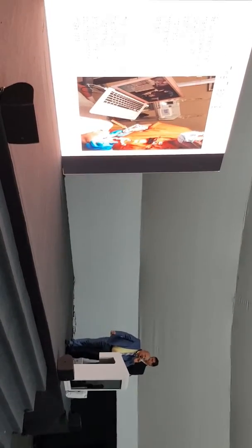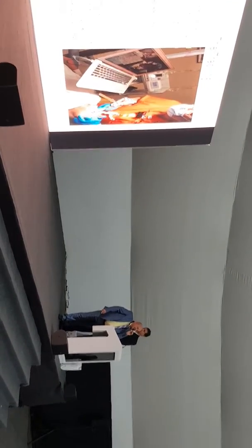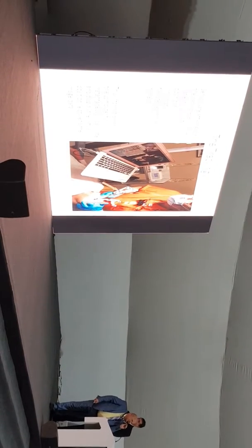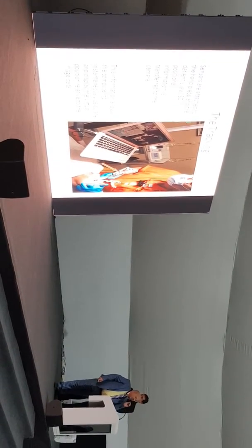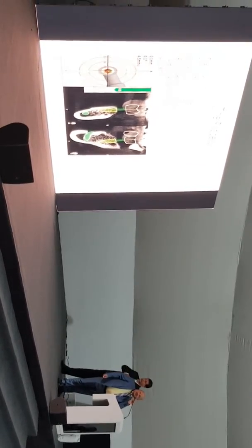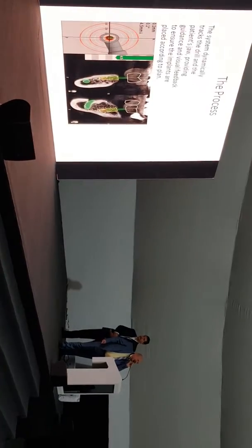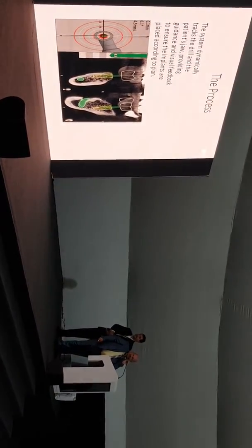So this dynamic navigation helps us in different kinds of surgery, whatever the situation of our patient. It also helps us in endodontic treatment, where we have a calcified canal or a canal we are unable to find. We will speak about it later.